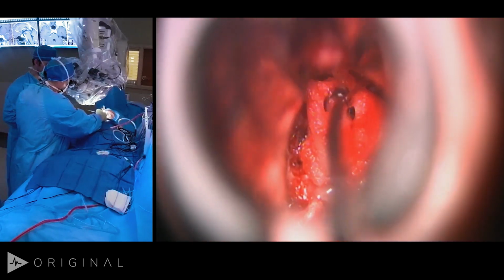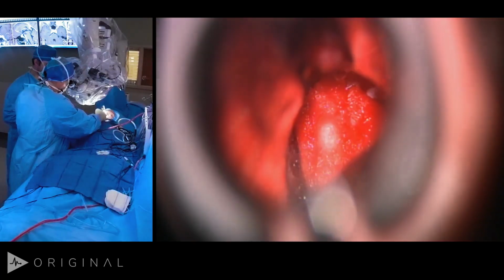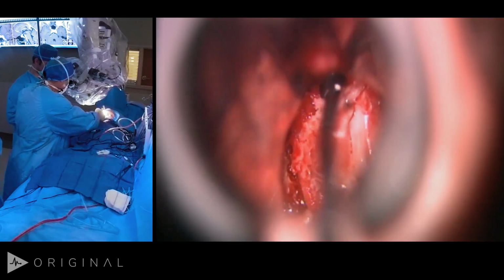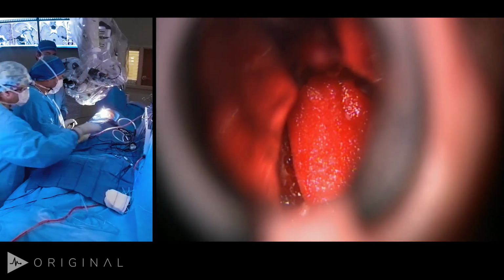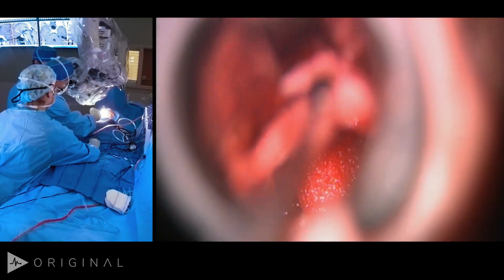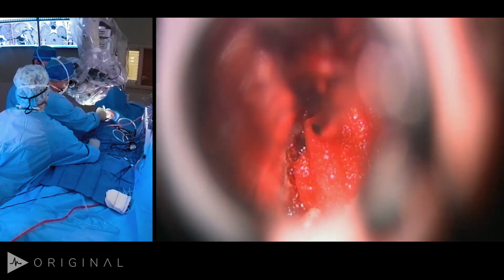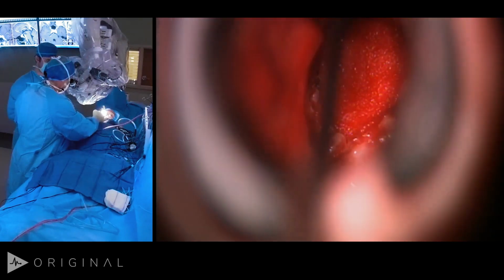Sometimes I'll take some nasal cartilage and put it subdural. Sometimes I'll take a piece of bone and carve it out and put it across. Although some of our ENT surgeons don't really appreciate that maneuver and they worry that it could be a source of infection. So I usually ask my ENT colleague if they have any preference, and if they do, then I won't do that. I happen to know that this ENT surgeon probably prefers that I not do that, and hence we won't. So now we can call our ENT surgeons to close.